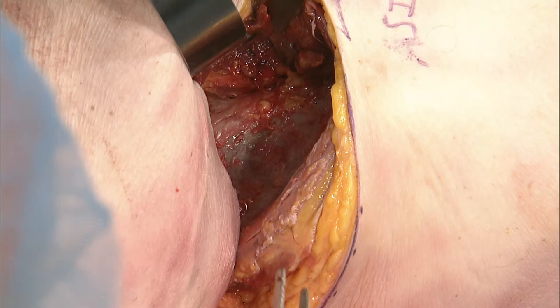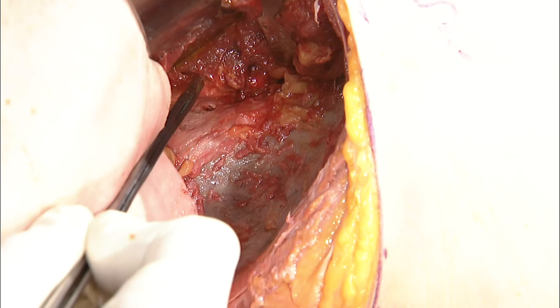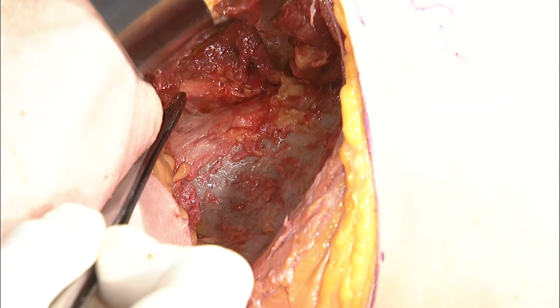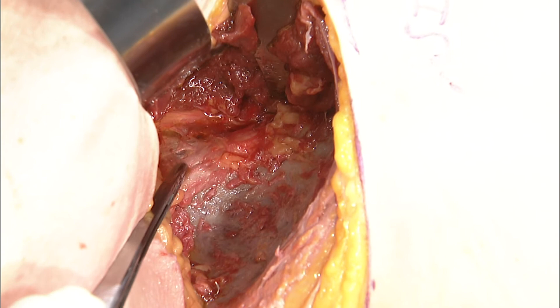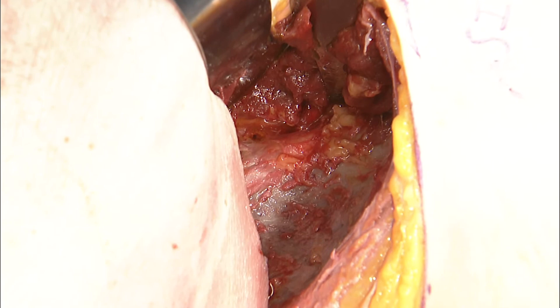This exposure is really going to show you the L5 nerve root. Looking in here: this is the inner table of the ilium, this is the SI joint, and here you see the white structure — that is the L5 nerve root. Most times we don't plan on exposing the L5 nerve root, but we want to know exactly where it is. This is a very good example: we're about 1.2 centimeters away from the SI joint at the distal aspect. You can certainly go looking for the L5 nerve root today to get comfortable with that.